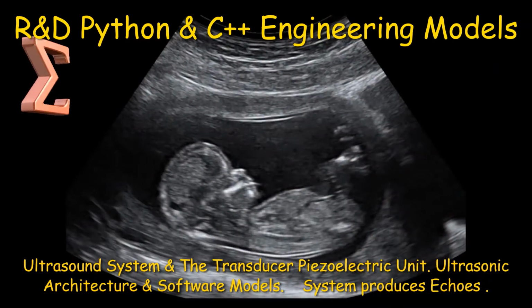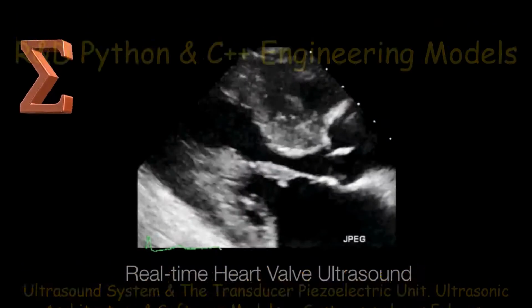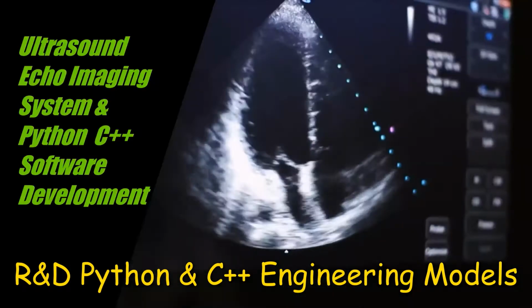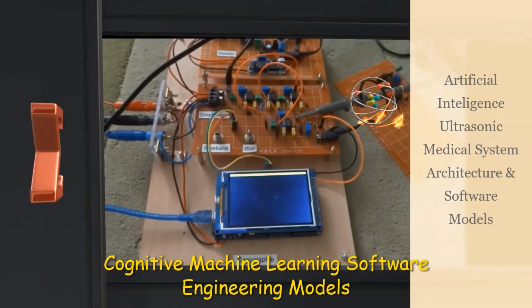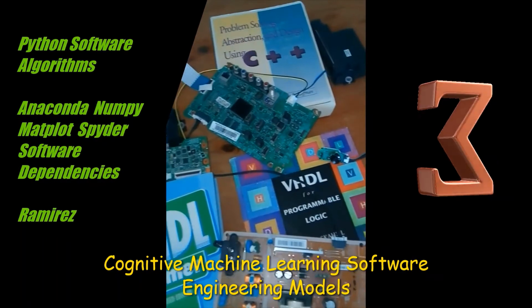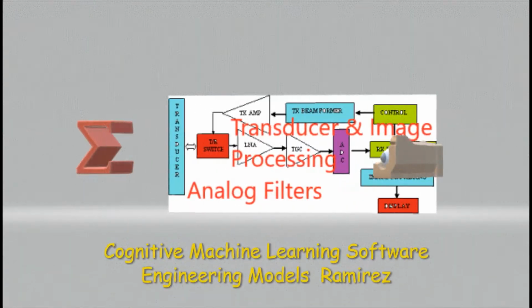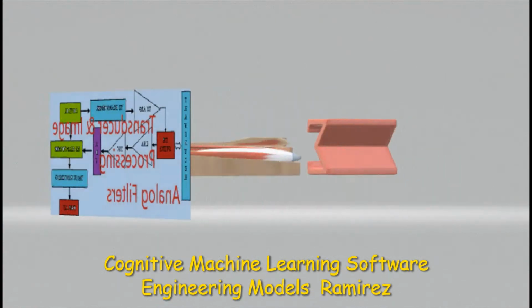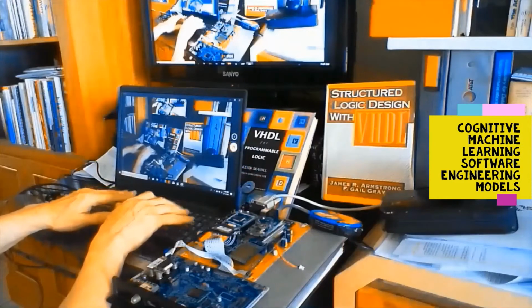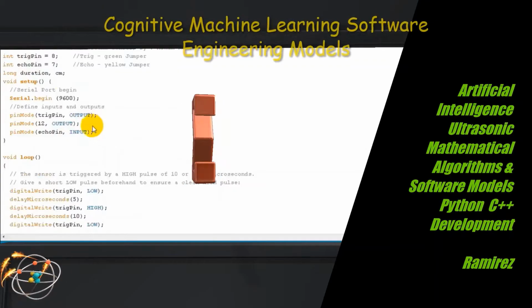These pulses of sound are emitted from the transducer and propagated through the different media being imaged, and then return to the transducer as reflected echoes of an interface. These reflected echoes are converted back into electrical signals by the transducer and are further processed to form the final image.